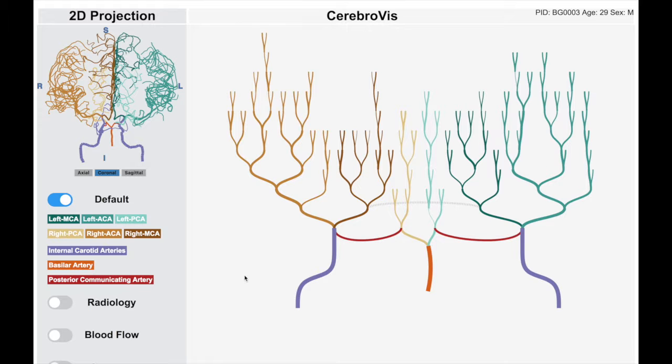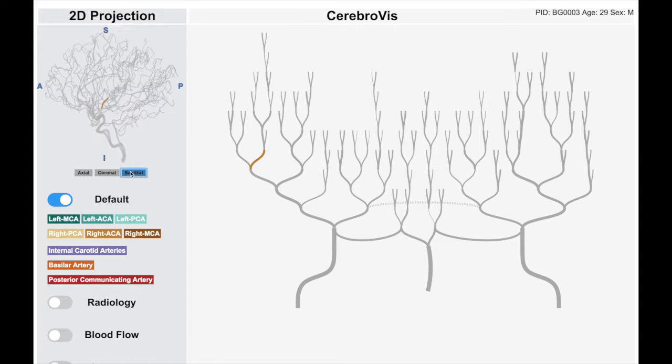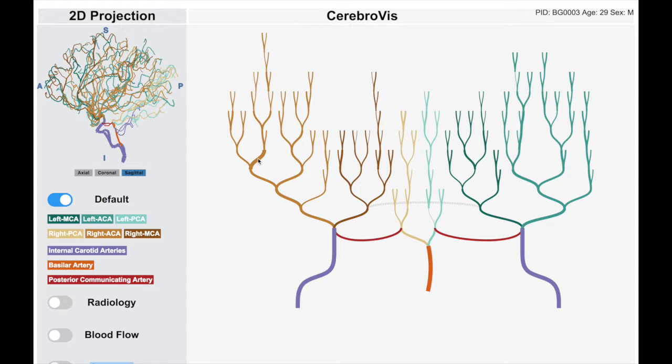The 2D brain projection and Cerebral Vis are linked in our prototype. We identified that the linked views are essential for experts to examine the true geometry of the arteries. Additionally, the linked view can also assist in finding smaller arteries in the human brain.